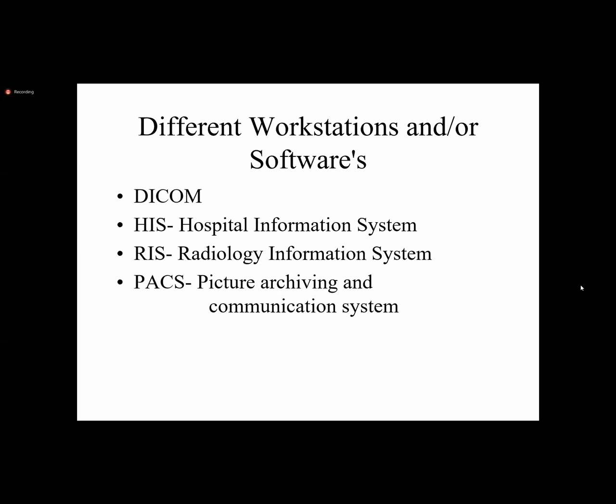Next we have RIS, that is the Radiology Information System. RIS works under the HIS. We can say this is a sub part of the Hospital Information System. Once we enter the patient's details into the HIS and put the examination details, like which procedure he or she came for, like a chest X-ray, chest PA view, we mark the examination in the HIS software, but it reflects in the RIS, the Radiology Information System. That means it works as a sub part of HIS.